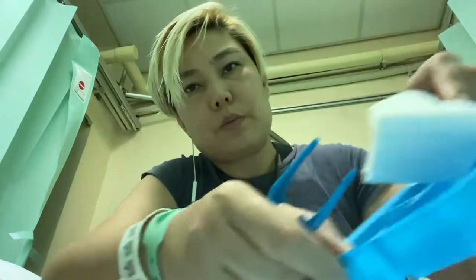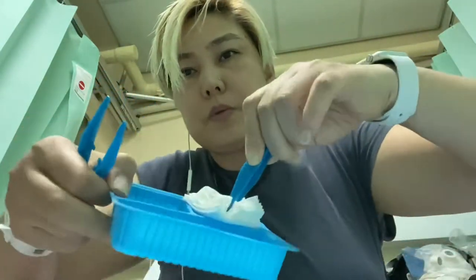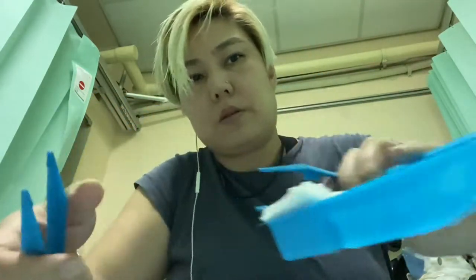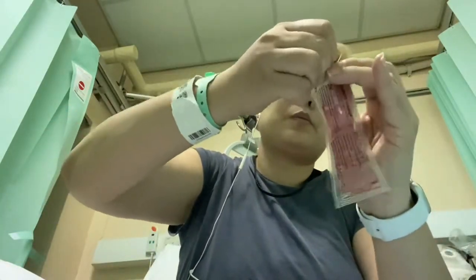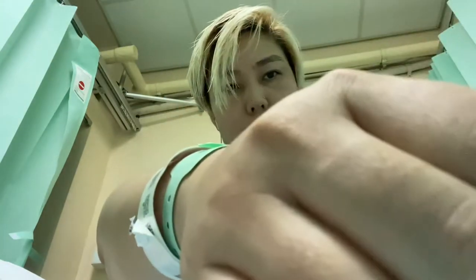And then we have two blue clips and some dry gauze, and some small gauze. And then we have two sections. I will put this one inside here, and I will put the applicators on both sides — one side is for the gauze, and one side for the syringe. I'm gonna use the syringe only the soft side. I will show you guys later.